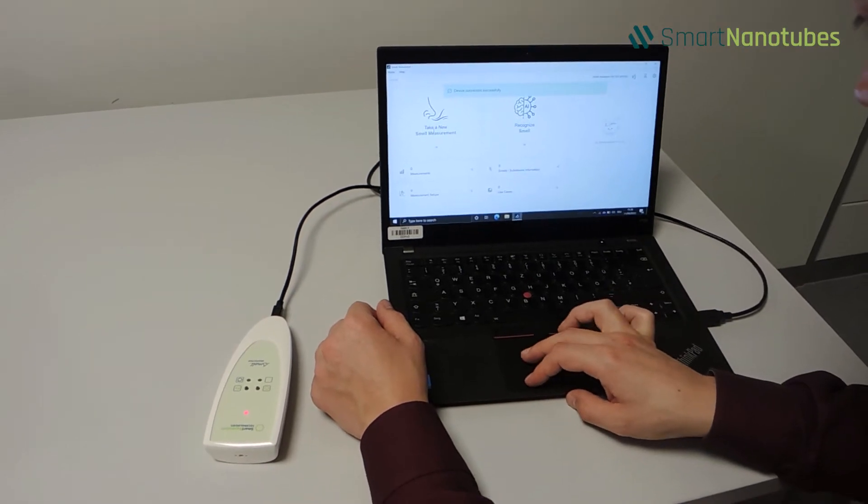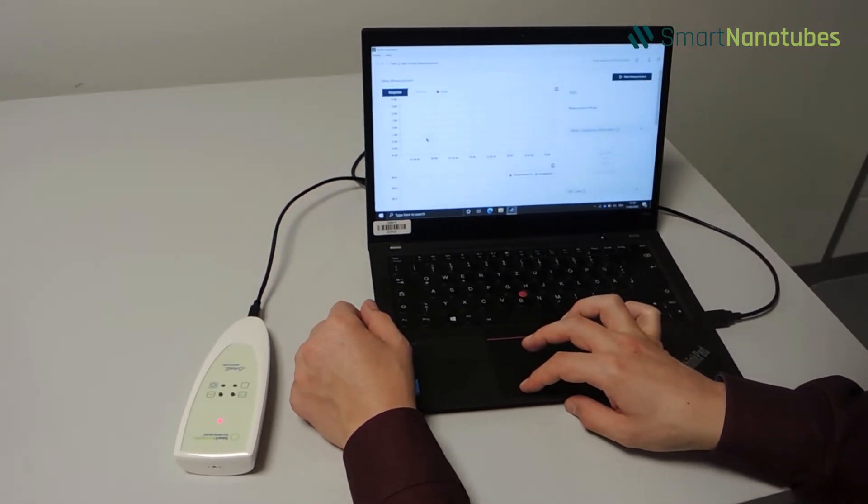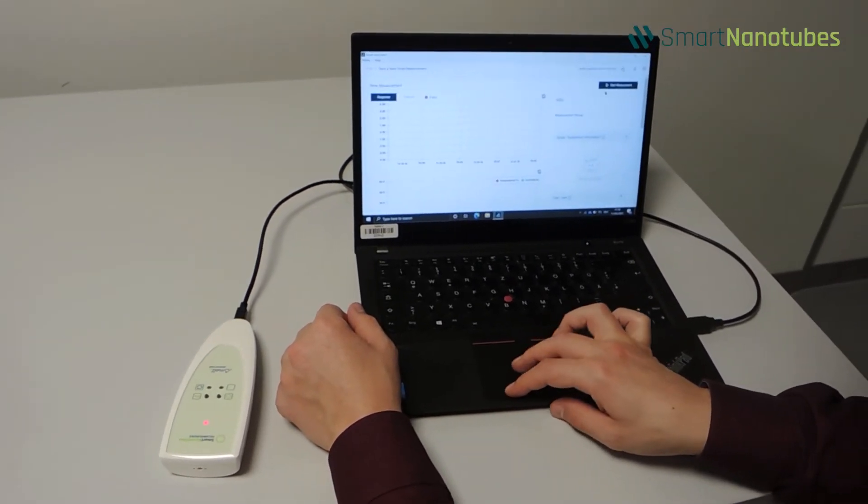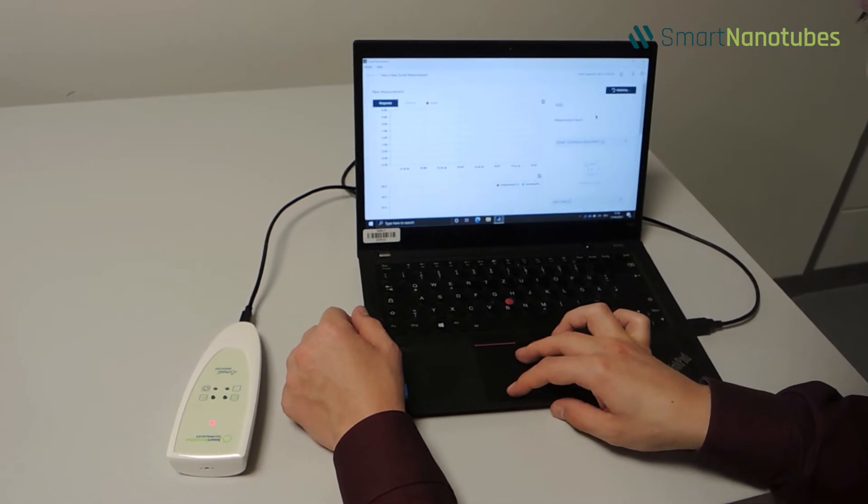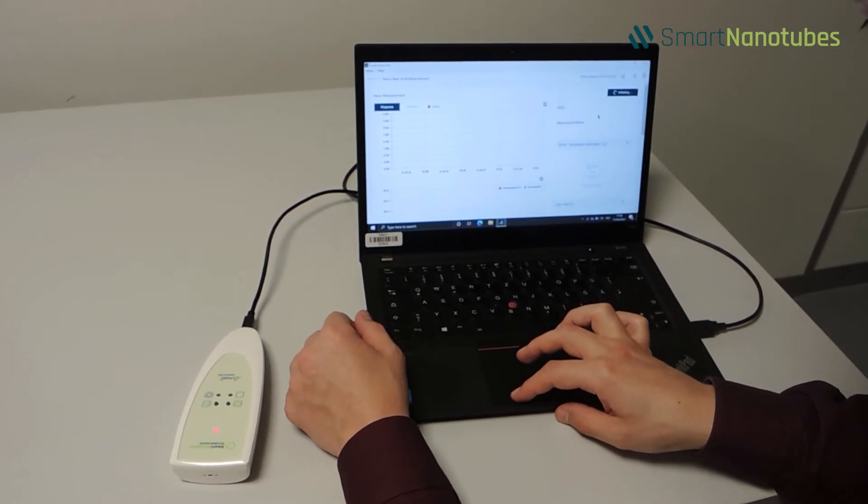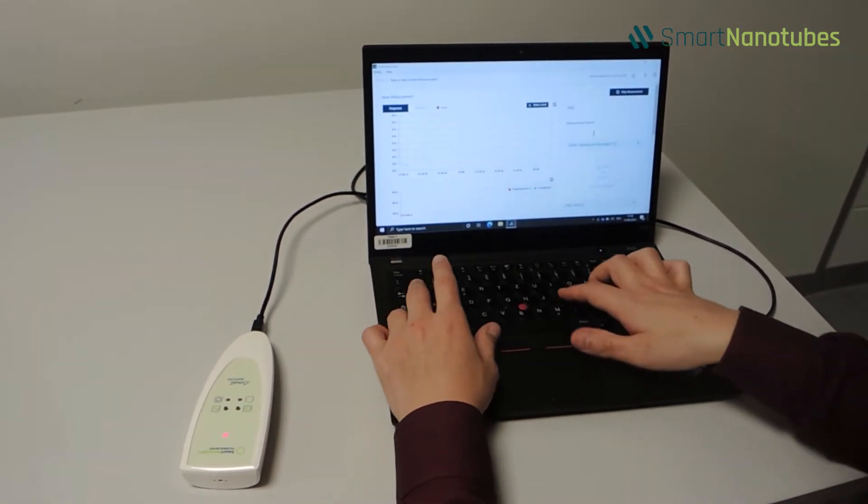To take a new measurement after connecting successfully, select Take a new Smell measurement. Once you've started the measurement, fill in the necessary information.